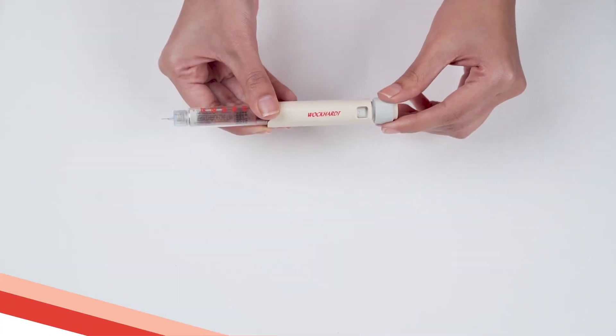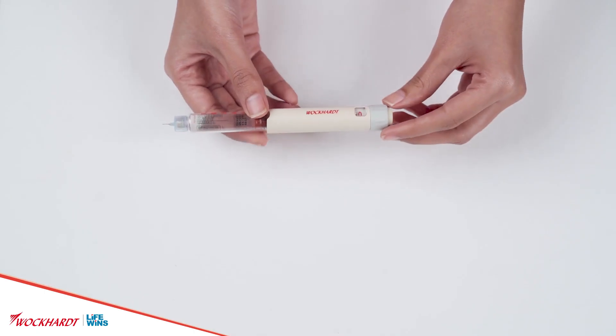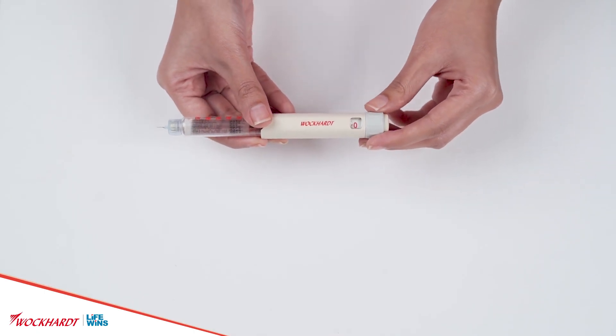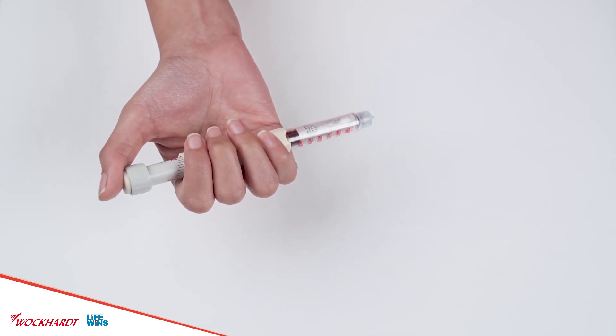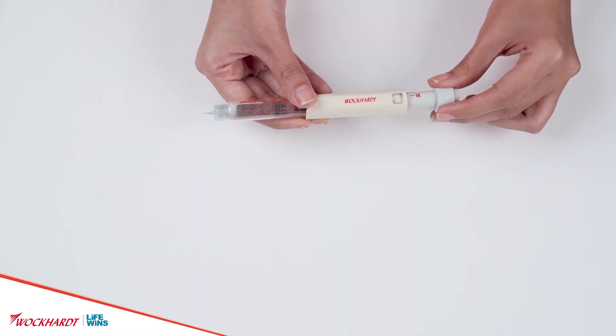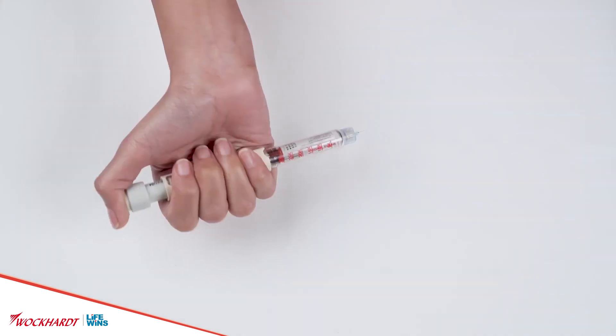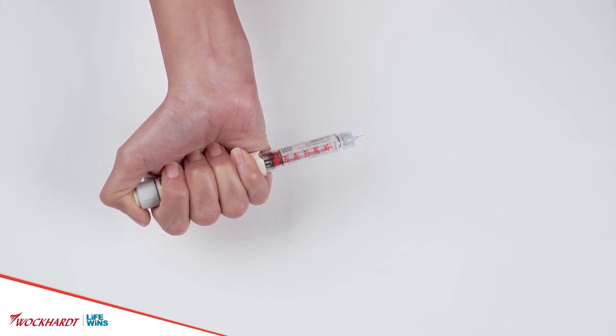Priming: it is important to prime the pen before use to ensure full dose delivery of EPO. Always ensure there are no air bubbles before you take your injection. In case of any visible bubbles, ensure that the dose indicator points to zero. Hold the Vipox Pen with the needle pointing in the upward direction. Tap the cartridge holder gently with your finger a few times to raise any air bubbles to the top of the cartridge. Now dial 2 units by rotating the dose dialer and push the dialer completely until the dose indicator returns to zero and a drop of erythropoietin appears at the tip of the needle.